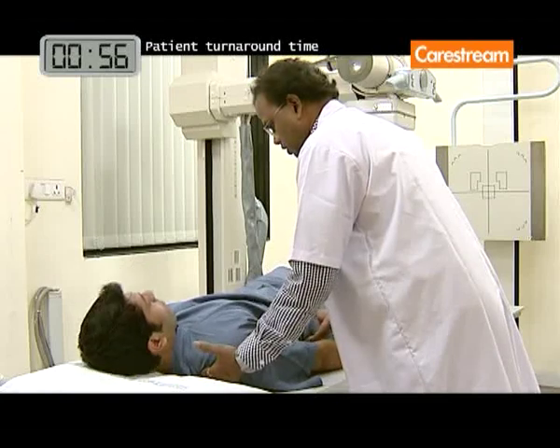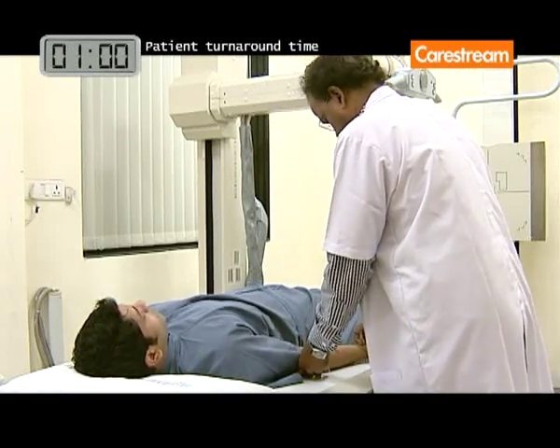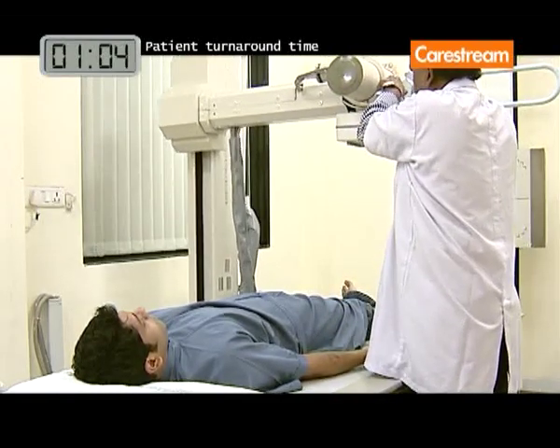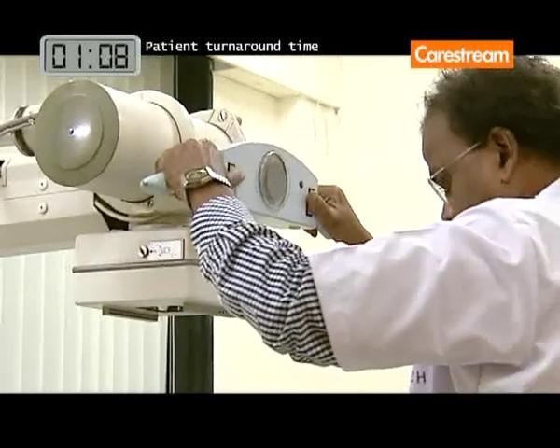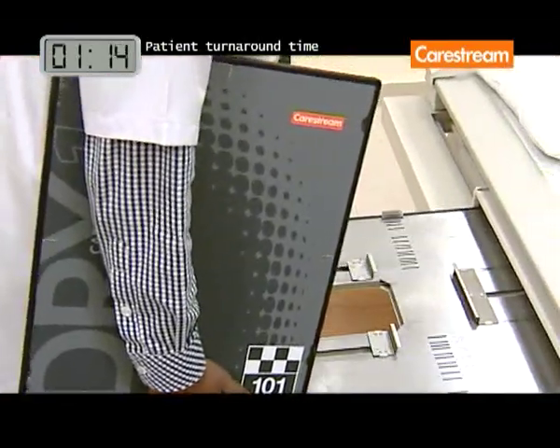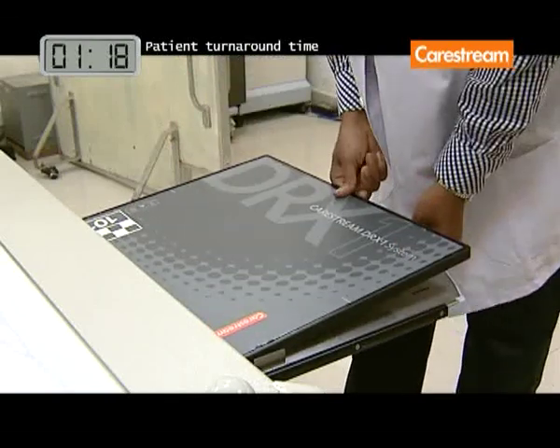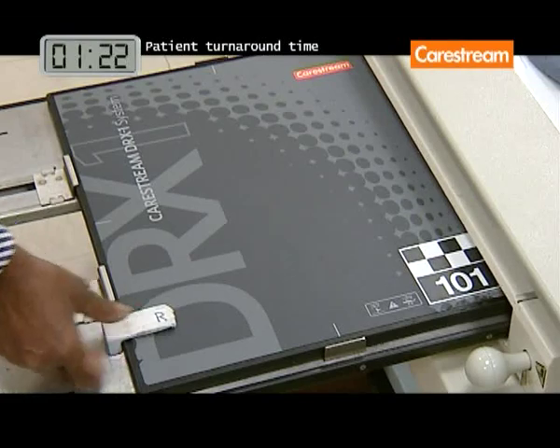In fact, the DRX-1 system can be installed in your exam room in just half a day. The CareStream DRX-1 system is designed to fit X-ray systems that use ISO 4090 compliant 35 by 43 cm X-ray cassettes.